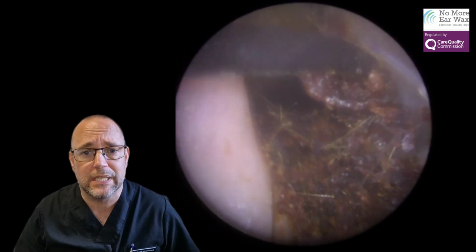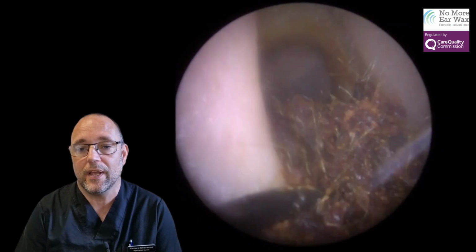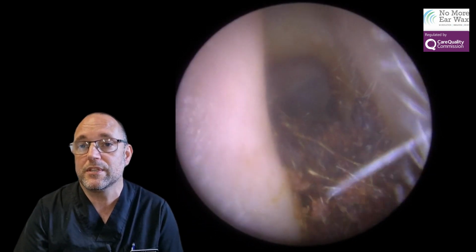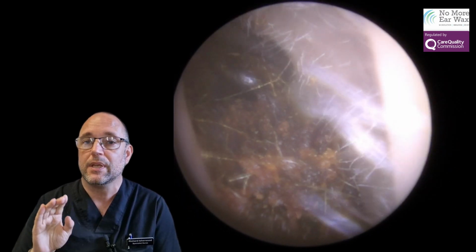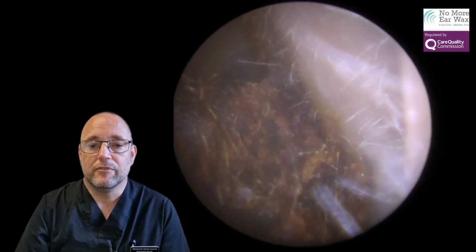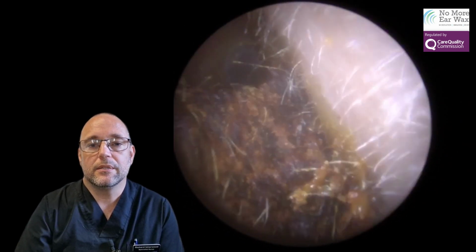Apart from the earwax, obviously. But as you can see, this one here, it's just crumbling apart. Whilst it is quite solid and quite hard, every time I put the inserter through it, it just tends to break it, which is fine because it's still bringing bits forward, it's still coming away. But because it's breaking it apart too much there, I decided to go back with the Jobson horn. It's basically like a little spoon with a hole in the middle, if you've not seen them before. And again, that just scraped the first bit off. But what I'm trying to do is just get behind it.